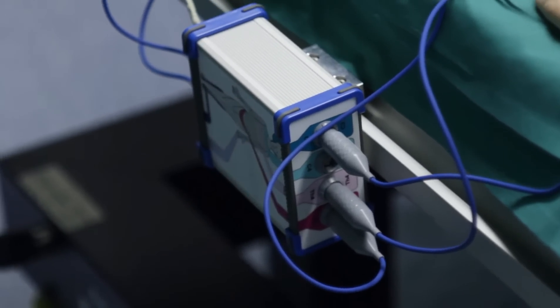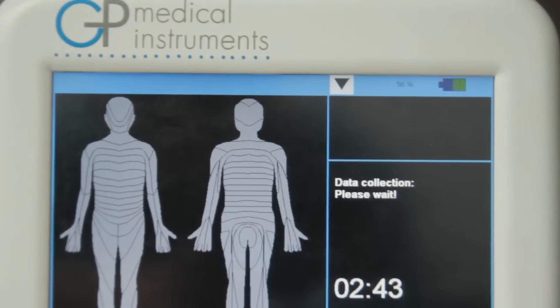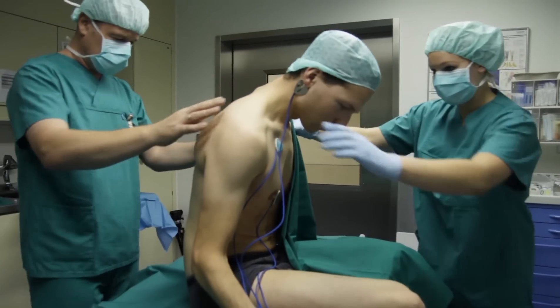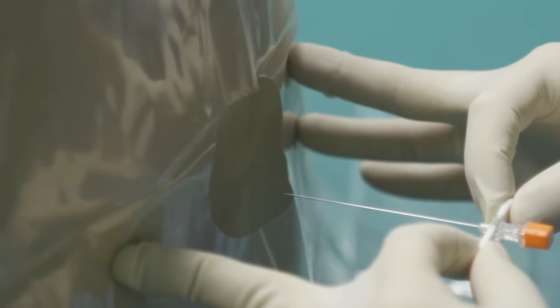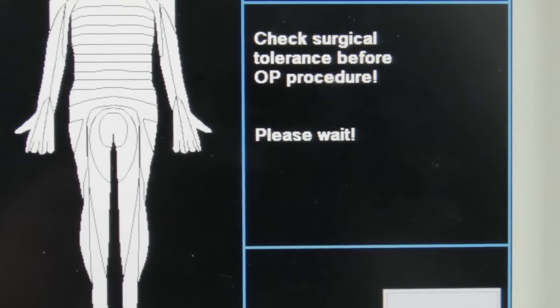It is important to place the sensors correctly on the dermatomes as described in the manual for the product to be functional. After four minutes' warming phase we inject the spinal anesthesia. It is important to confirm the performed injection on the screen — the doctor says the spinal injection is performed and the surgical nurse presses the button on the touch screen.